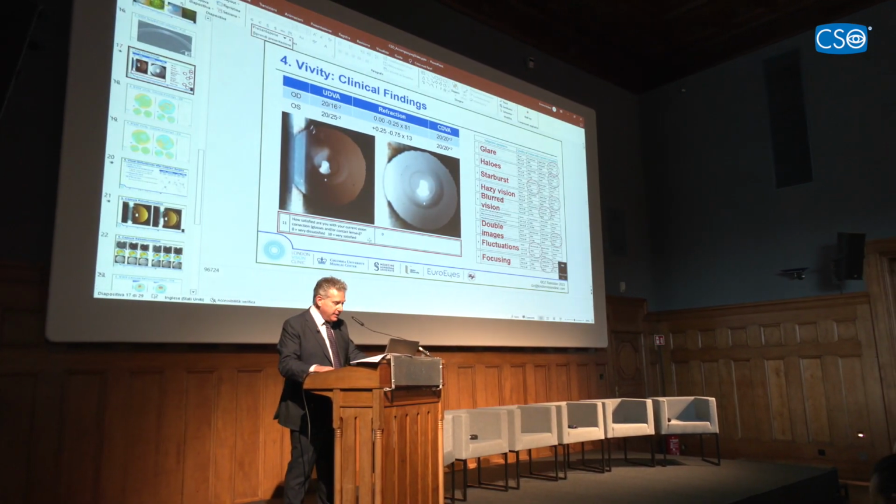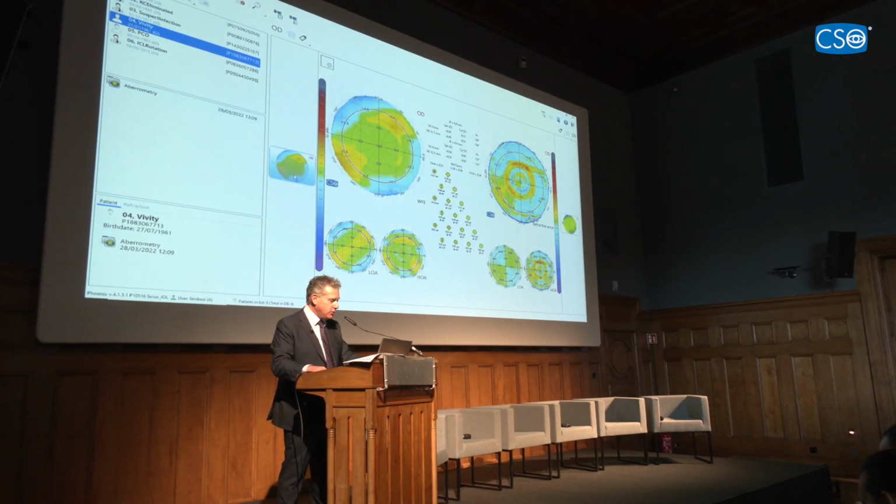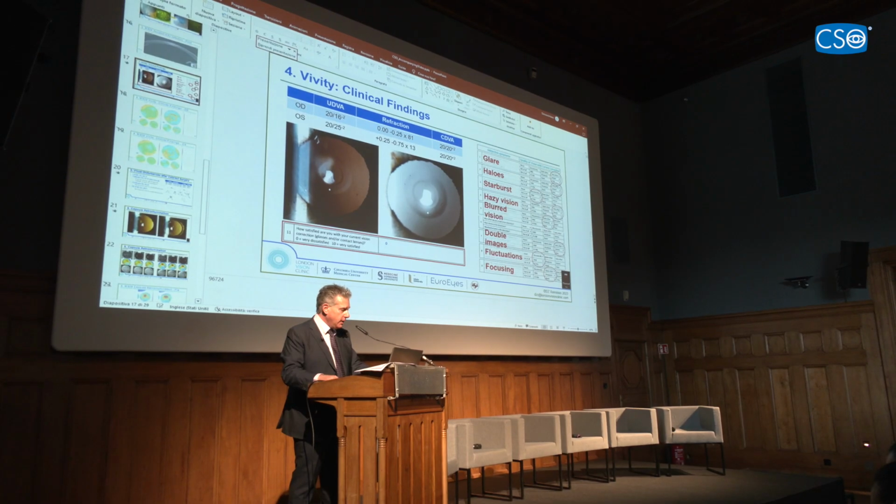Now, again, I did exactly what you suggested, Francesco, and I went to the Osiris, because that is our diagnostic tool for optics.